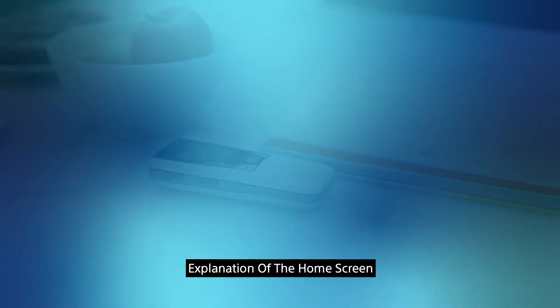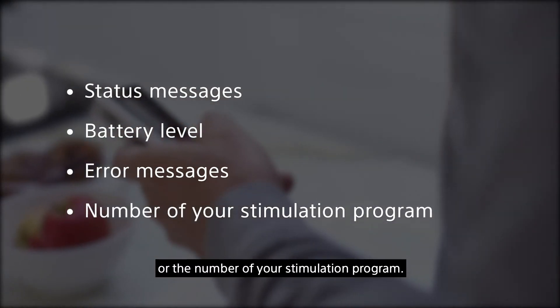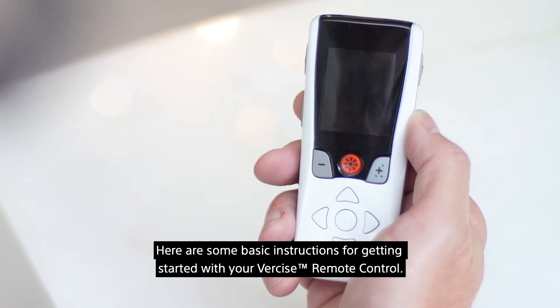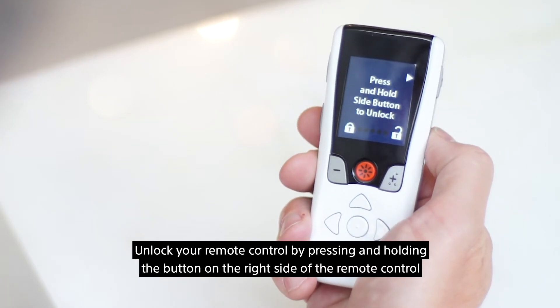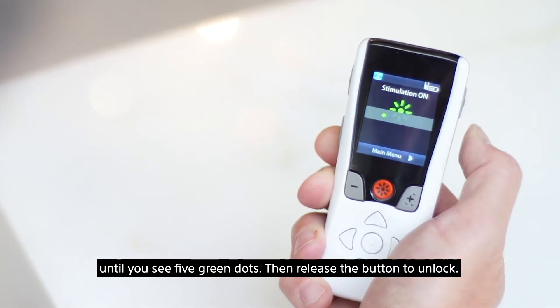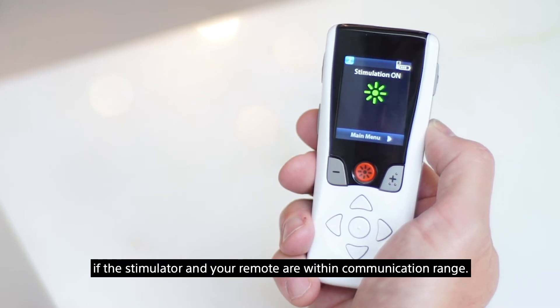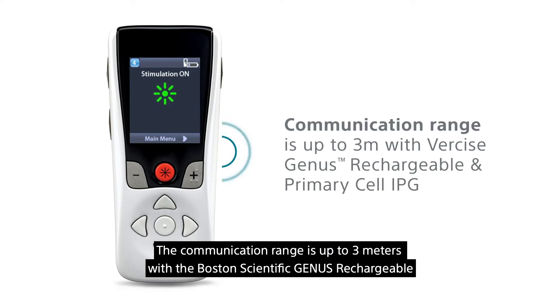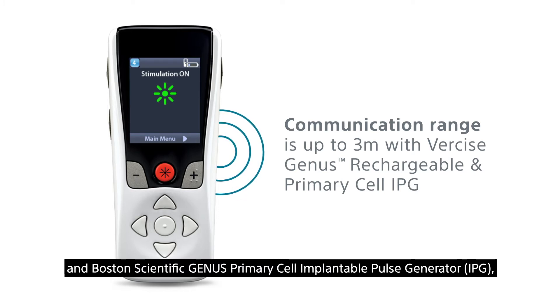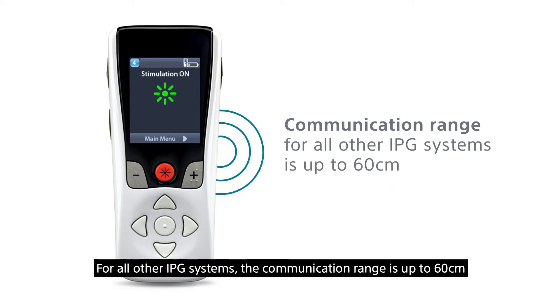The home screen of the remote control displays different information like status messages, battery level, error messages, or the number of your stimulation program. Unlock your remote control by pressing and holding the button on the right side until you see five green dots, then release the button to unlock. Your remote control should then connect automatically to your stimulator if they are within communication range. The communication range is up to three meters with the Boston Scientific Genus rechargeable and Boston Scientific Genus primary cell implantable pulse generator (IPG). For all other IPG systems, the communication range is up to 60 centimeters.